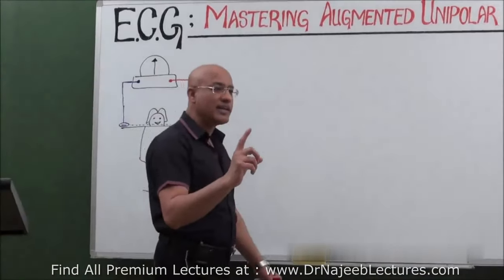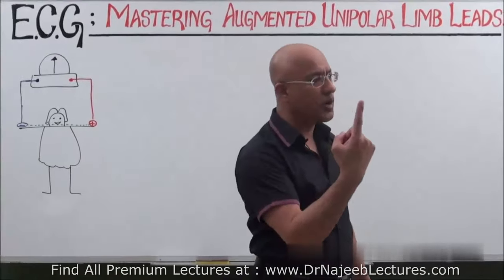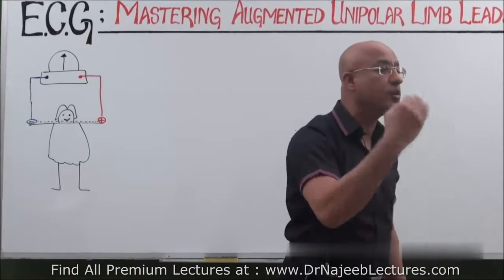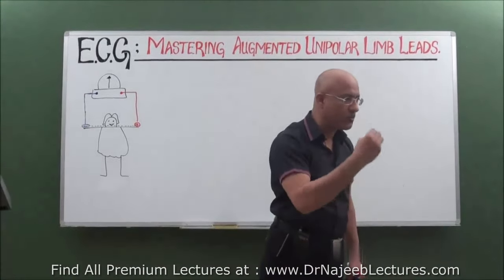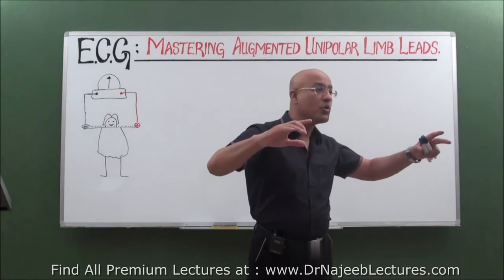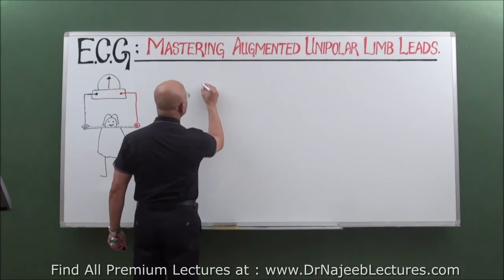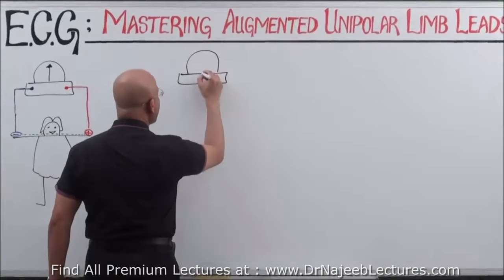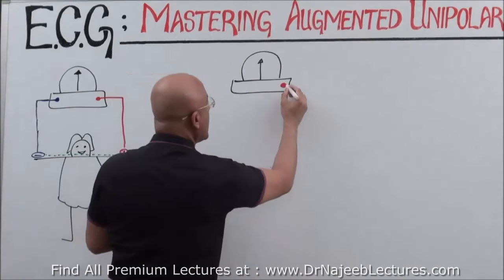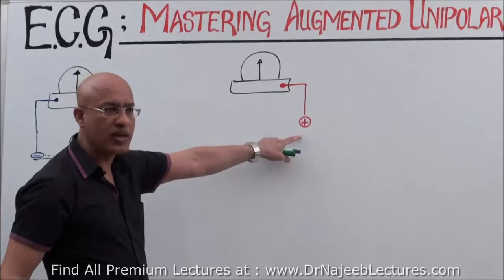When I ask students about unipolar leads, most of them answer, sir, it's very simple, a unipolar lead has one pole. This is absolutely wrong, because with just one pole, one electrode, you cannot determine the voltage differential or the potential difference. Actually, all unipolar leads are modified bipolars. Let me tell you how. Let me construct a unipolar lead here. Like a bipolar lead, a unipolar lead has a positive terminal, and with it a positive electrode, which can be applied at one part of the skin.